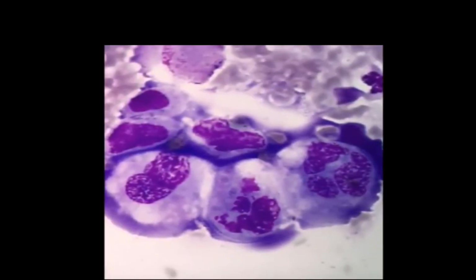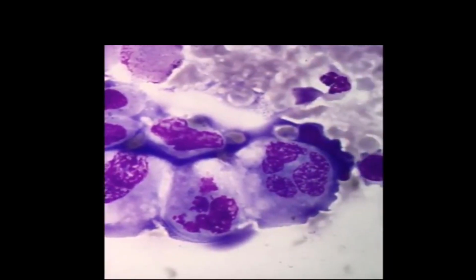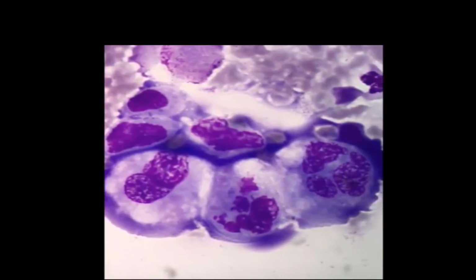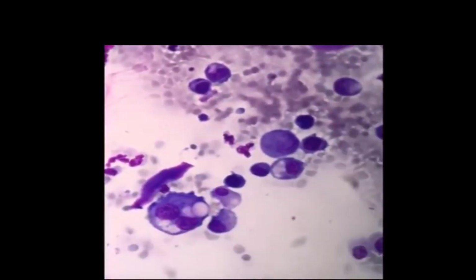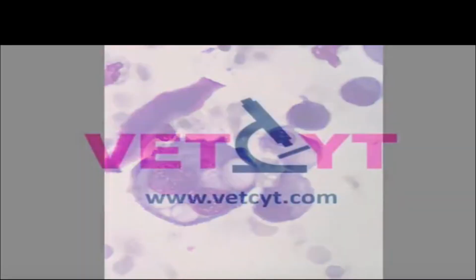What you can see here is another area of multinucleation. To the right, the presence of anisokaryosis within a cell, which has an odd number of nuclei, and in the centre, a cell in unsynchronized mitosis. We change the field of view again, and what is interesting in this cell is that they have vacuoles with a pink granular contents, classical for transitional cells, which you will remember from the very first presentation in this series of the prostatic carcinoma.